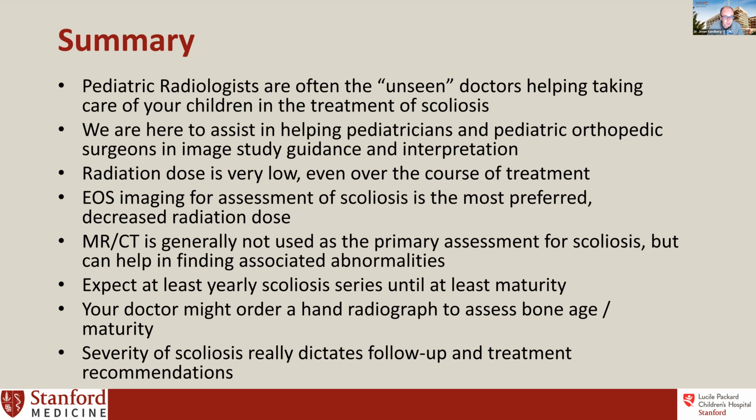EOS imaging for assessment of scoliosis is the most preferred method, and it really provides the decreased radiation dose. MRI and CT are generally not used as the primary assessment for scoliosis, but can help in finding associated abnormalities. Expect at least yearly scoliosis series until at least maturity. And your doctor might order a hand radiograph to assess bone age and maturity. And then severity of scoliosis really dictates follow-up and treatment recommendations.